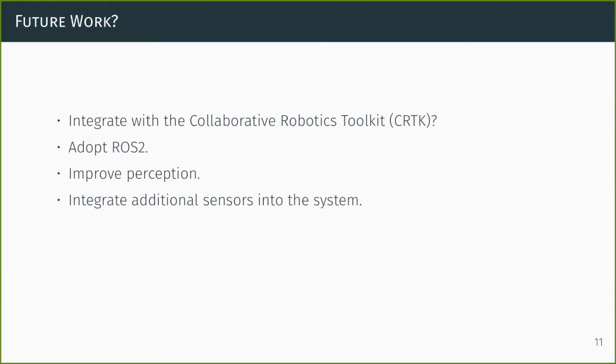One advantage of using this kind of system is that you can more easily, I would argue, integrate more sensors into the system. For example, the UR5E robot that we used for one of the manipulators in our setup has a force sensor in the wrist already, which we have used for contact detection, for example.